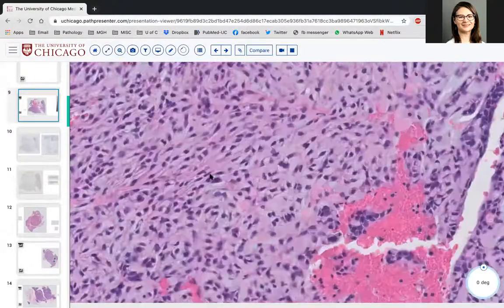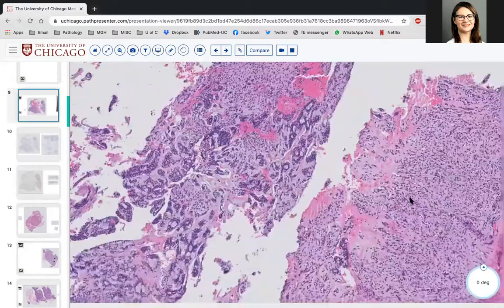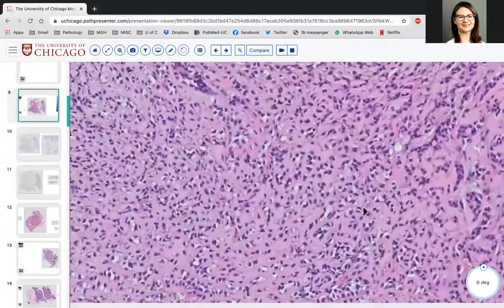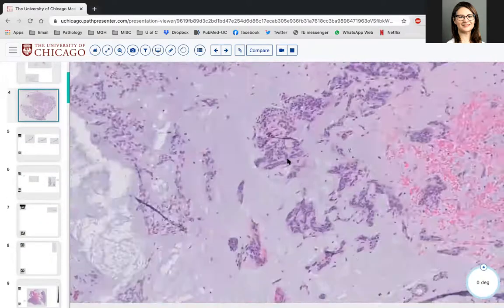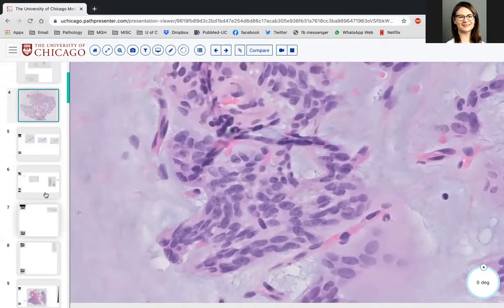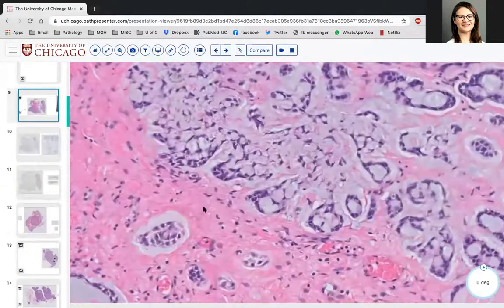there are features that are overlapping between pleomorphic adenoma. What I will say is that sometimes the cytomorphology of adenoid cystic is a little more, the nuclei tend to be a little more darker and wrinkled, whereas, in a PA, the nuclei tend to be a little more open and oval. So you can sometimes use that, but it can be hard on core because, of course, sometimes crush artifact makes the open oval cells even look kind of crushed and small.